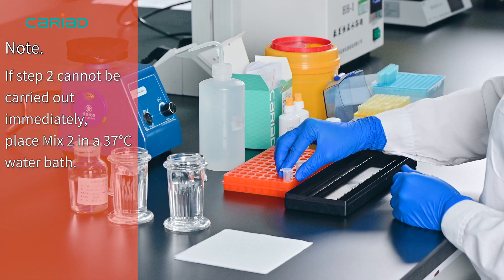Step 2. If it cannot be carried out immediately, place Mix 2 in a 37 degree water bath.